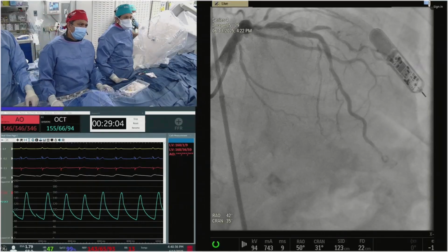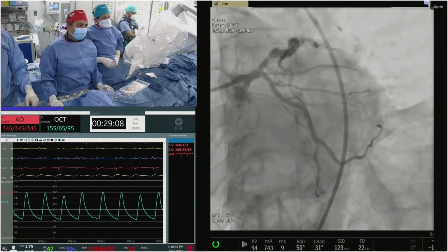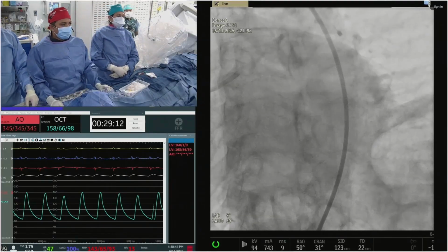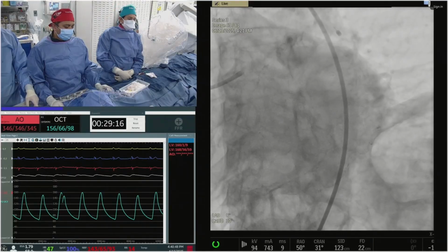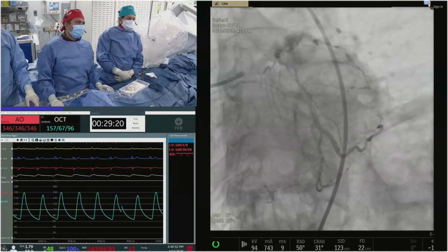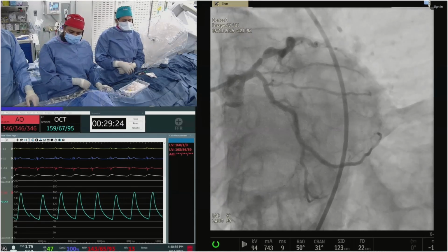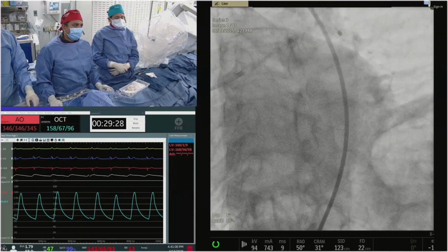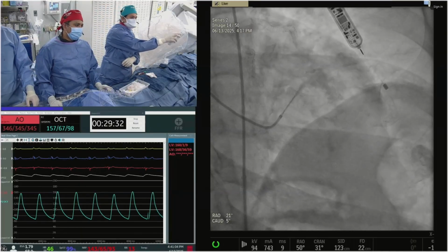He has a diagonal disease also. But given his age, we can just focus on one lesion. Now, having shown so many complex diseases, the theme here would be, again, how can we manage calcified lesions using imaging? His creatinine is good, so we decided we will do OCT, but let's take how would you approach this case that you have?